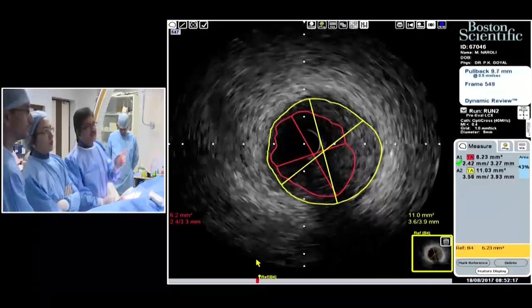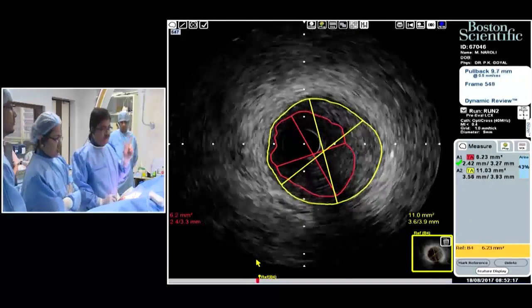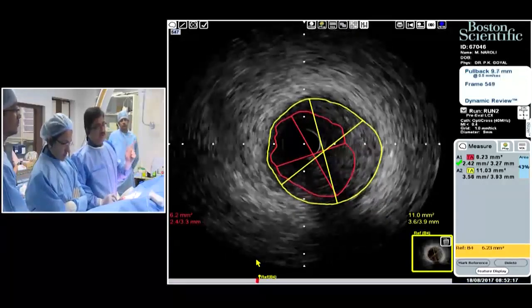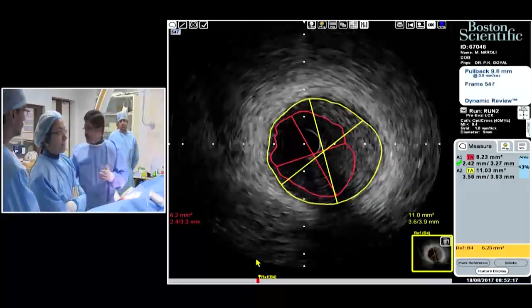Okay. Left main ostium. Yeah. No, I will leave it free. If the left main ostium is free, then I will not cover it. Okay. So we will see how we place it. So let us, if it's okay, I'll get the stent.